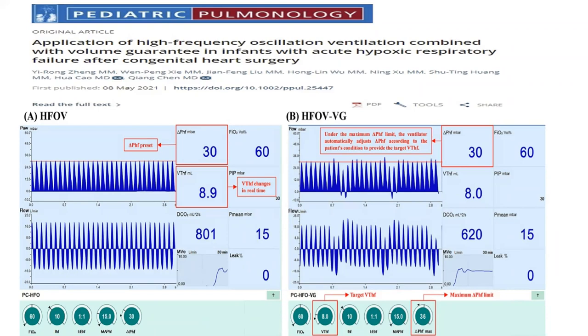Abdullah, if you allow me, I'm Abdullah Taib from BSCC. I want to make a few comments. First, the use of high frequency in cardiac ICU is still less common. High frequency was started by neonatologists, as we all know, and most of the studies on high frequency are from neonatology people. It is well tolerated, well adapted, and well done there.